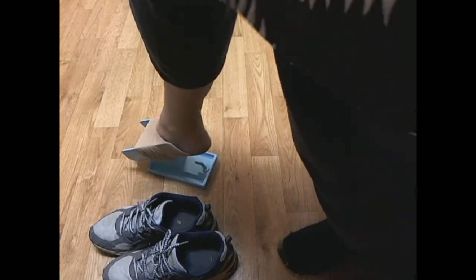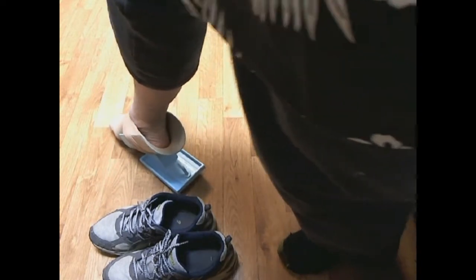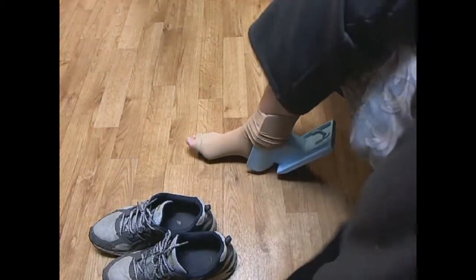And you may have to grab onto your walker or something like that. But you see how it's going on? And I'm getting my heel right where it needs to be. And they're on. Very simple.